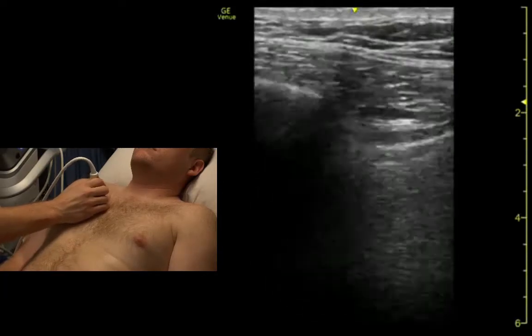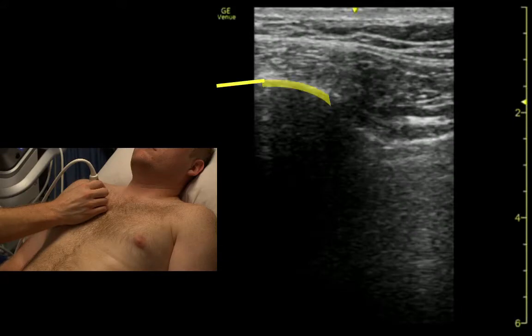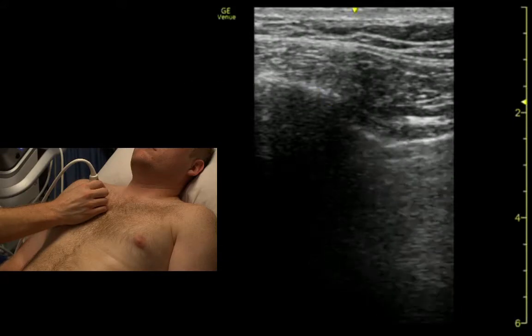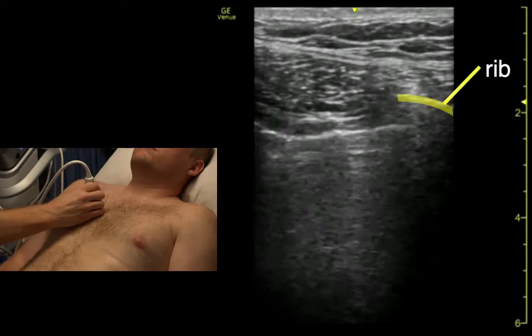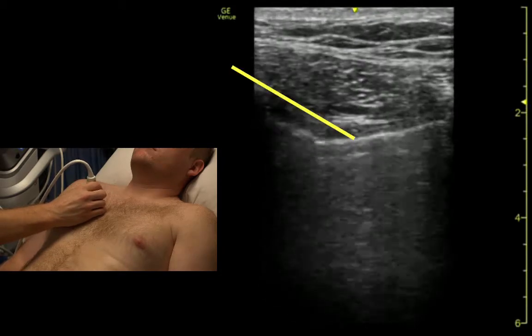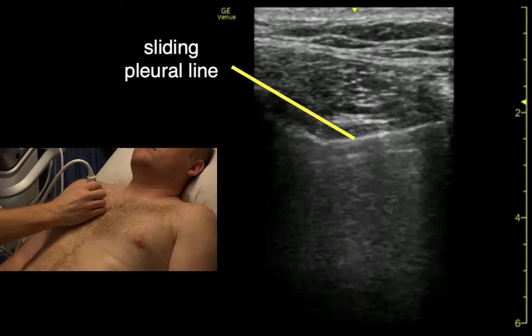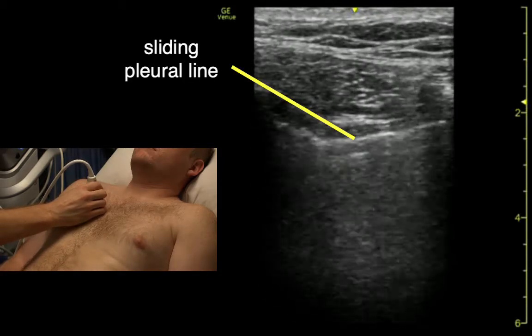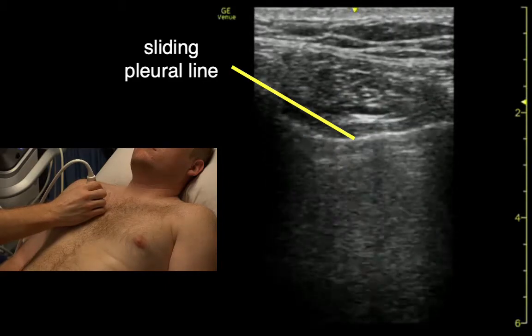So if we look here, we can identify — here's a rib, here's a rib, and in between that we see the pleural sliding.